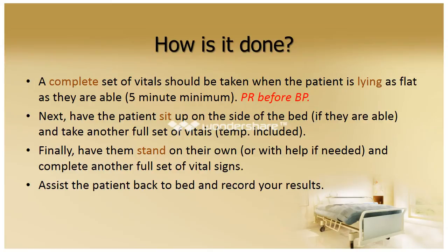And again, after you obtain your first set, record it and then move on to the next one. Try not to rely on your memory, and then make sure that you have the times, and we'll discuss the time recording in just a little bit. Before you do the sitting position, have the patient sit up for about a minute before you do the next set. Record all of the vitals and then move on to the next step. Again, if you need assistance with your standing, it's good to have someone before you get started.